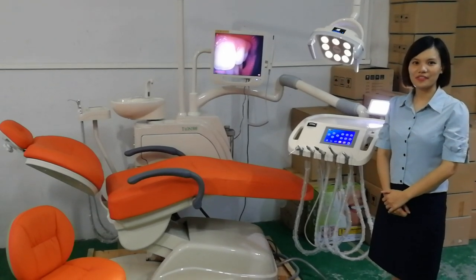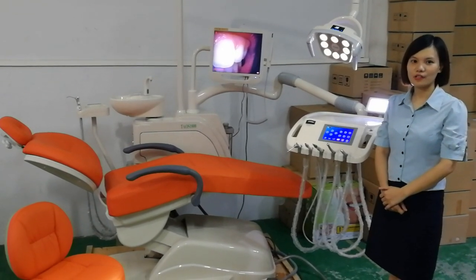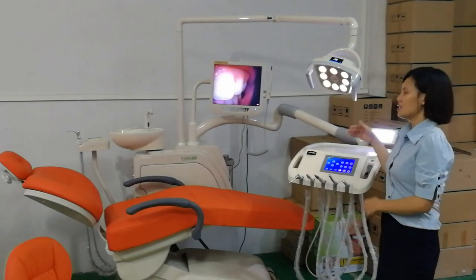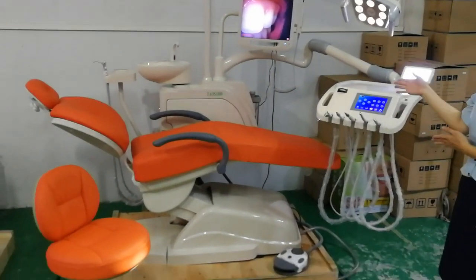Hello, this is Sophie from Lingchen Company. Today we share this modern dental chair, TAOS1800. We see this is one elegant chair.